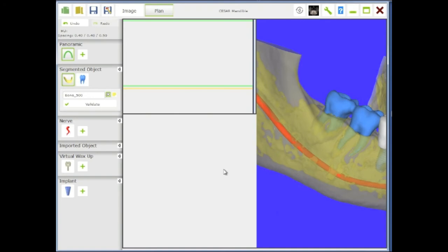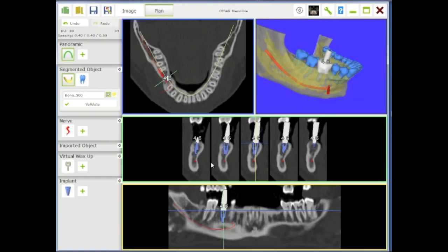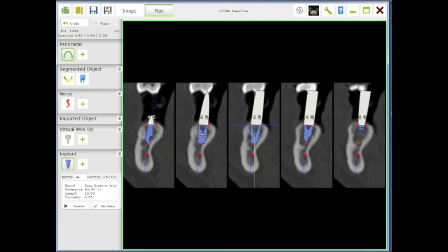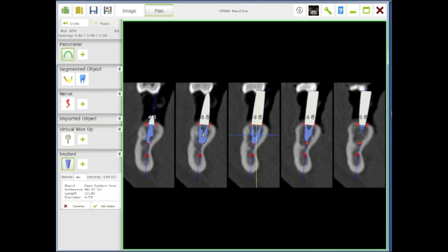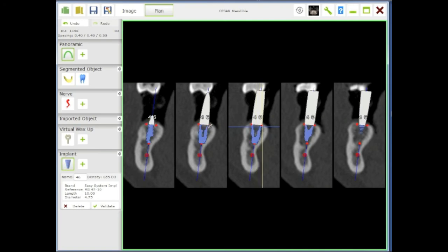You can do several things and I'm going to show you how to manipulate the implants. You can go at the bottom, in the middle of the implant, and you can move it around. You can go on top here and you can change the diameter, make it smaller or make it bigger, so no need to go to the list to do that.